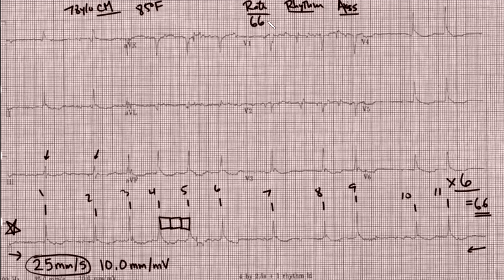What about the rhythm? Look at the rhythm strip again, and you'll notice that there are really no P waves before these QRS complexes. I do believe because of the irregularity and because of the lack of recognizable standard P waves that we're dealing with atrial fibrillation.